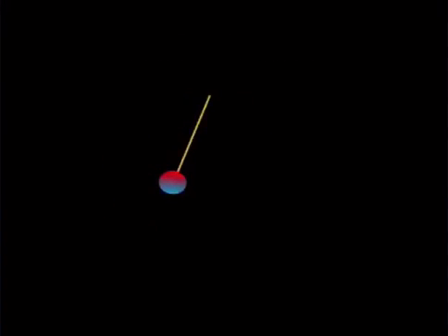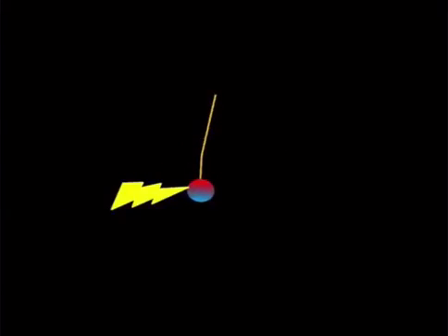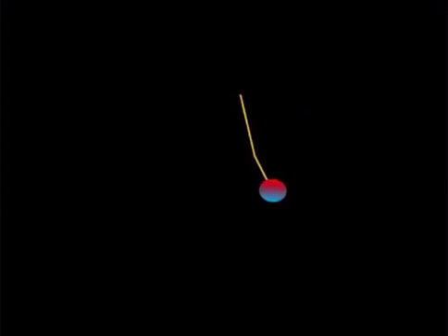So something like this, all right? So here's our hydrogen, and we want to deliver something to it here, so we're going to wait, we're going to push it, and you can see, there you go. So this RF pulse is sent at this specific Larmor frequency, and it's timed so that it gets that maximum push.